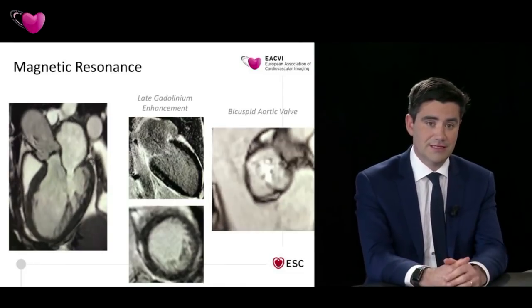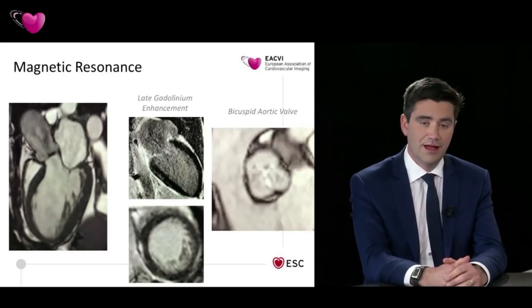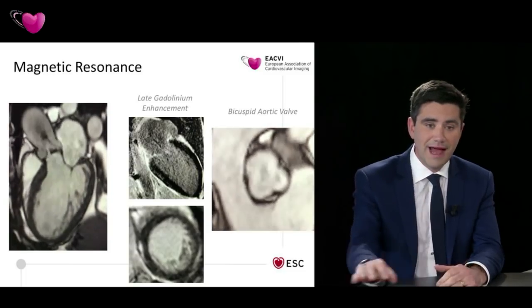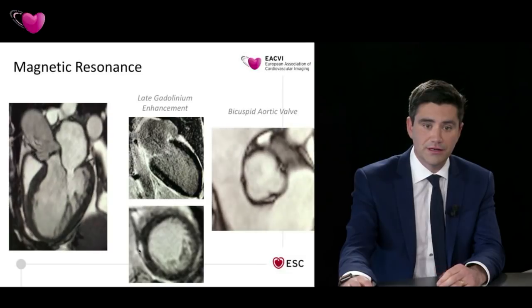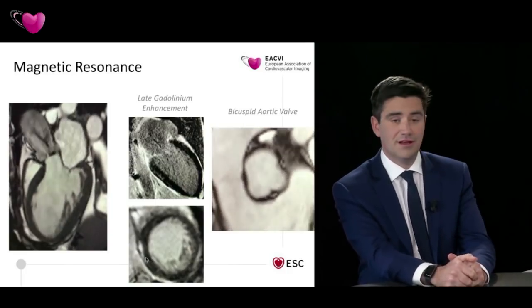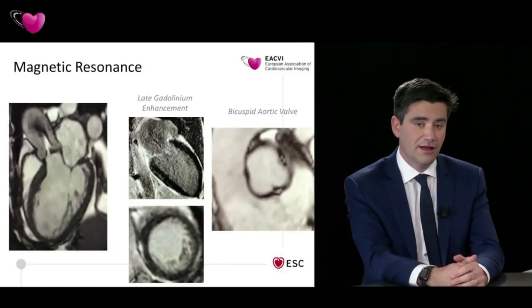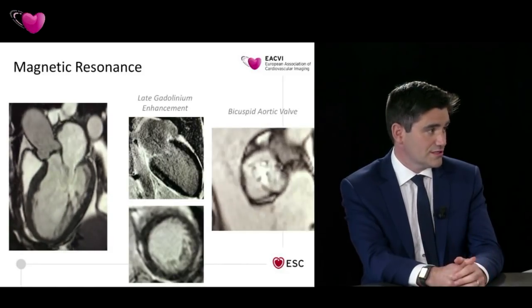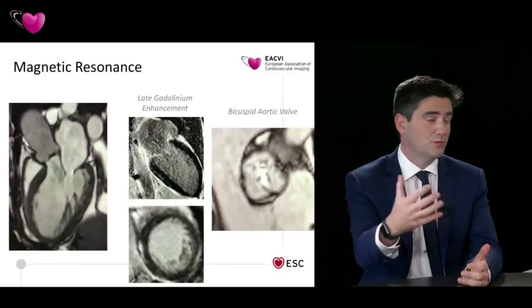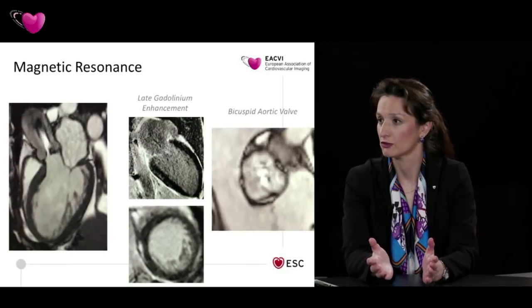This is not a patient who has an ischemic cardiomyopathy with multiple previous infarcts as the cause of her LV dysfunction. Neither does she have clear features of cardiac amyloidosis. There is perhaps a little bit of scarring down at the insertion point that you often see in patients with advanced aortic stenosis. But overall, our impression was that this myocardium was viable. There was a lot of healthy myocardium, so we thought this is likely due to her aortic stenosis, and more importantly that it is likely to recover if we replace the valve, and that we should move forward in that direction. So with CMR, you have defined the etiology of that heart failure.